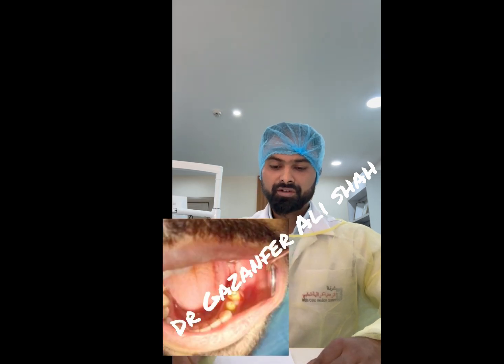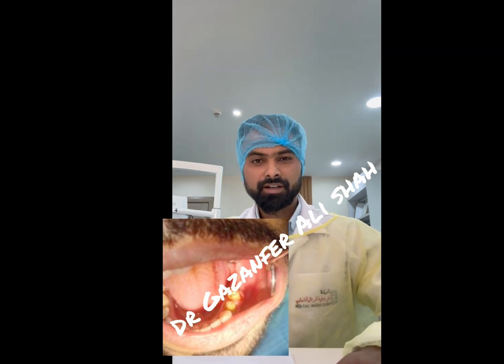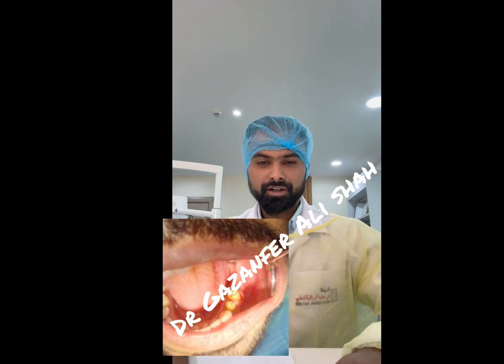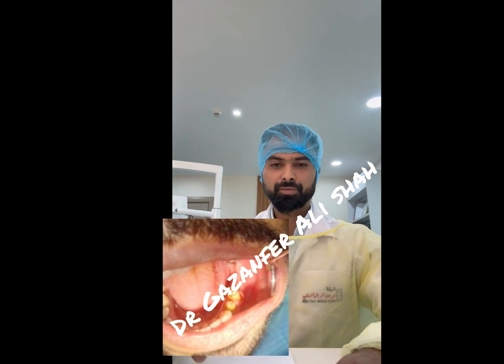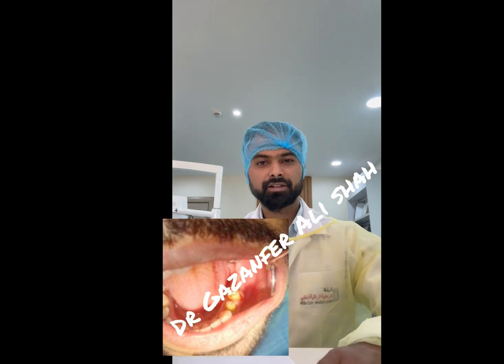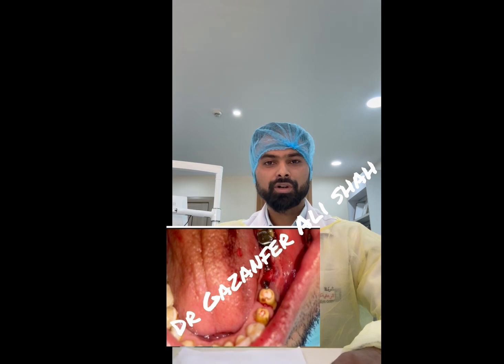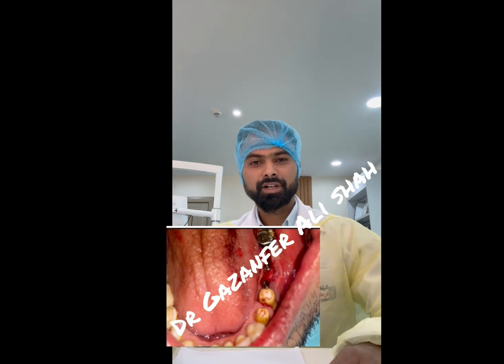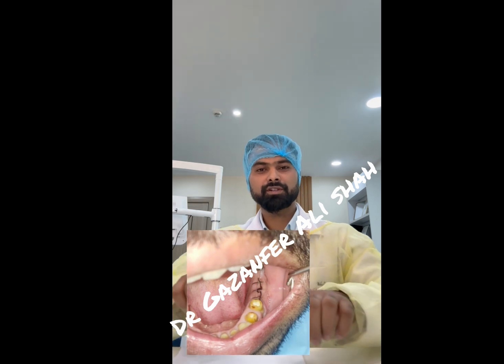A crestal incision is given posterior to the premolar. After the crestal incision, the flap is reflected. A pilot drill is used in order to locate the exact osteotomy. After the osteotomy is prepared, we are using a guide pin to check angulation with the adjacent anatomical structures. The implant is fixed into the bone. After that, an interrupted suture is placed so that primary closure is achieved.